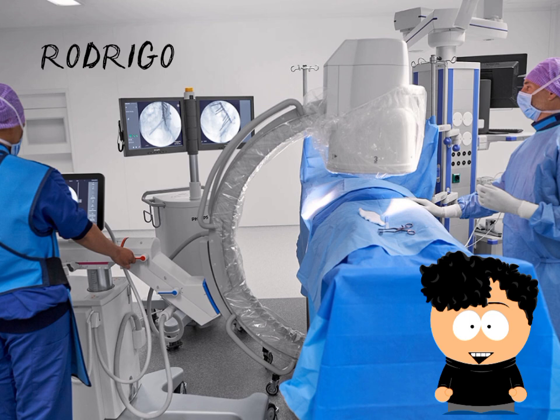X-ray generator produces the X-rays used to obtain images. X-ray tube emits X-rays towards the patient. X-ray detector captures X-rays that pass through the patient's body and converts them into electrical signals. C-arm: the C-shaped design allows for greater flexibility and access to the patient during procedures.